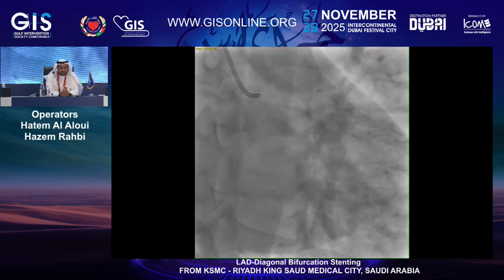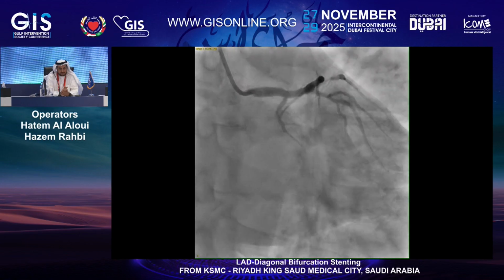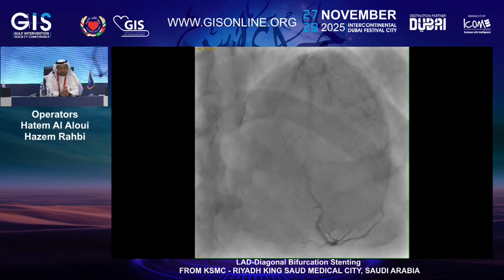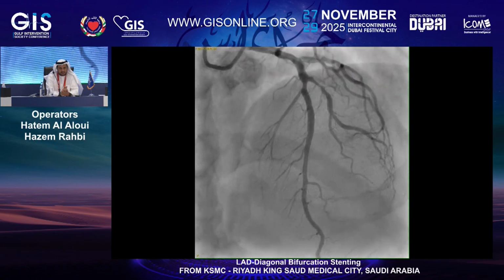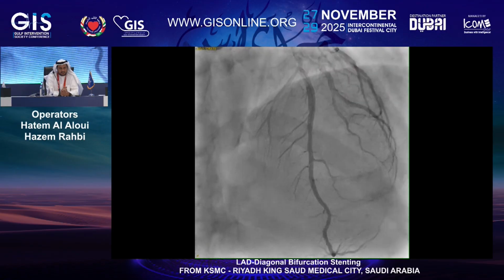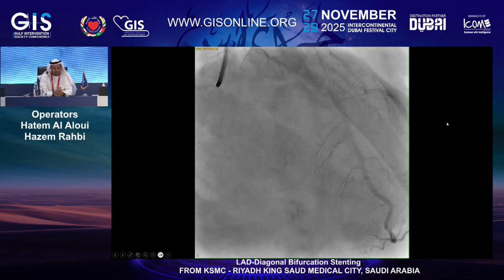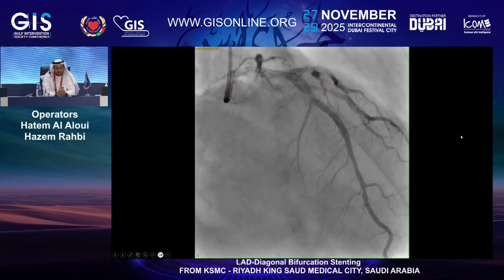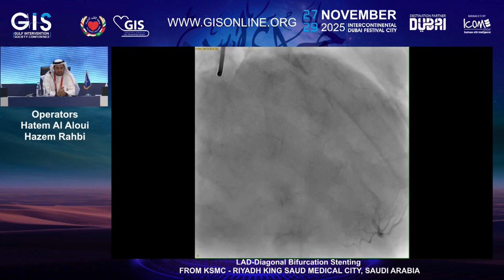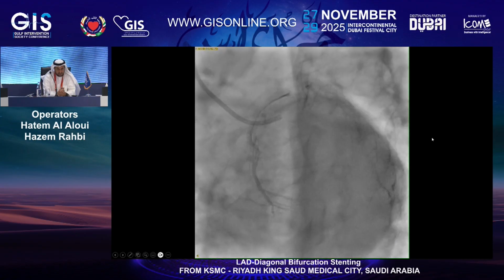The angio was done on November the 6th. This is the left system. So the caudal view. In the cranial view here, you can appreciate a moderate lesion on the ostioproximal LAD and a significant 011 lesion on the bifurcation LAD diagonal. And in the next view, you will see that it is much more significant. A clear significant lesion in the LAD, just near the ostium of the septal, immediately after the diagonal branch. Nothing relevant in the spider view except a small circumflex.